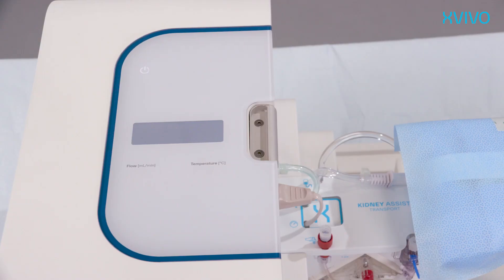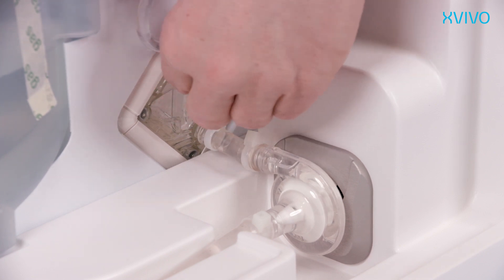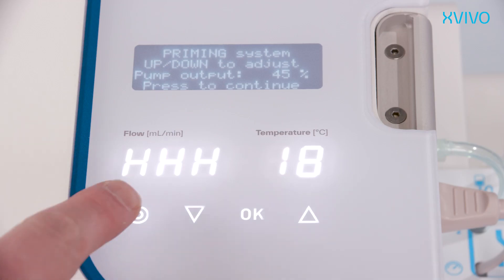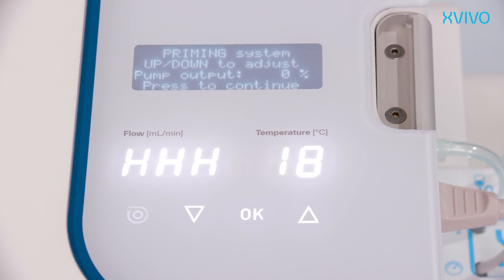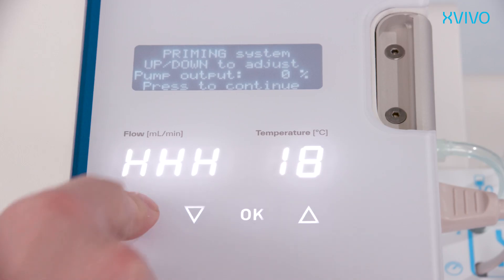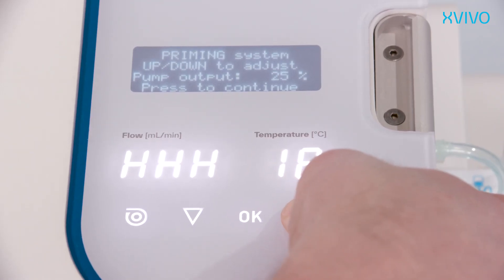Power on the Kidney Assist Transport device by pressing the power button continuously. During setup, guidance is shown on the display. In priming mode, de-air all tubing, pump head, oxygenator, and pressure sensor. Remove the yellow cap of the de-airing membrane of the oxygenator. To remove air bubbles from the centrifugal pump, stop the pump manually by pushing the pump button — in most situations bubbles will automatically flow up. Remove bubbles manually when needed. Restart the pump and increase pump output by pushing the up button at the control panel. During priming, the pump output can remain at about 50%.